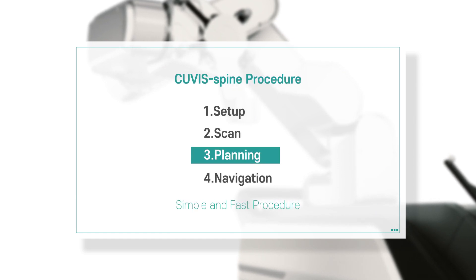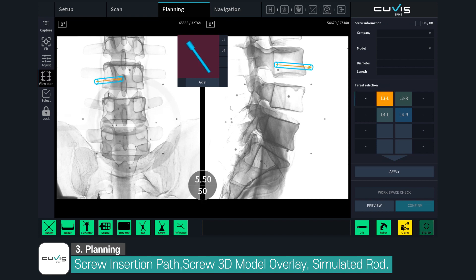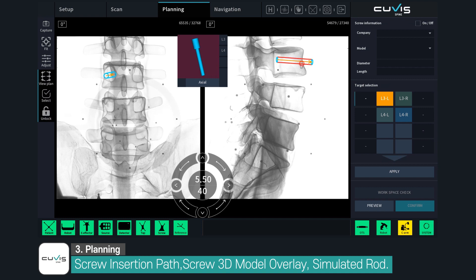Step 3: Planning. Surgical planning is carried out on AP and lateral images. A virtual pedicle screw is projected onto the images. The user only needs to determine the entry point, end point, and diameter of each pedicle screw.